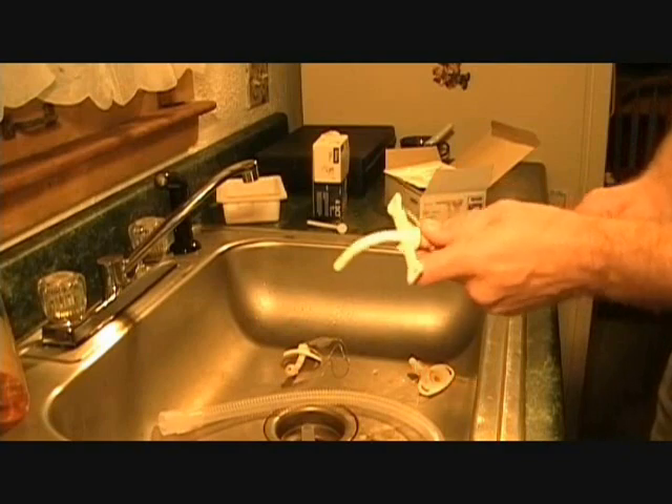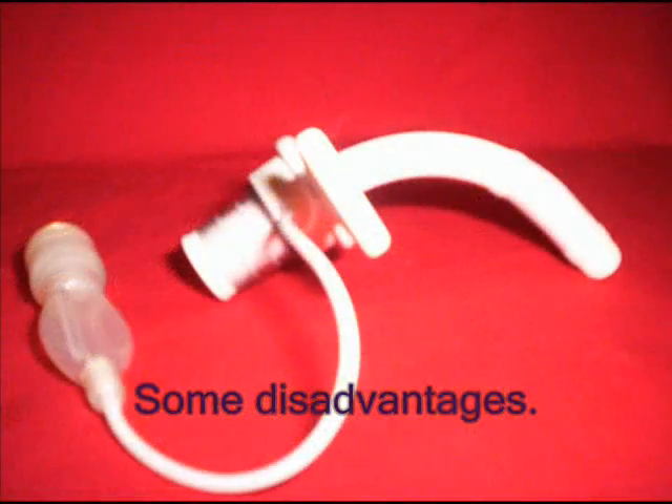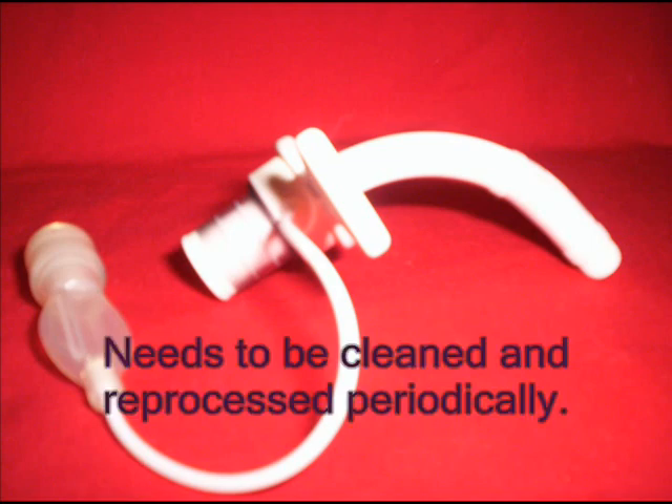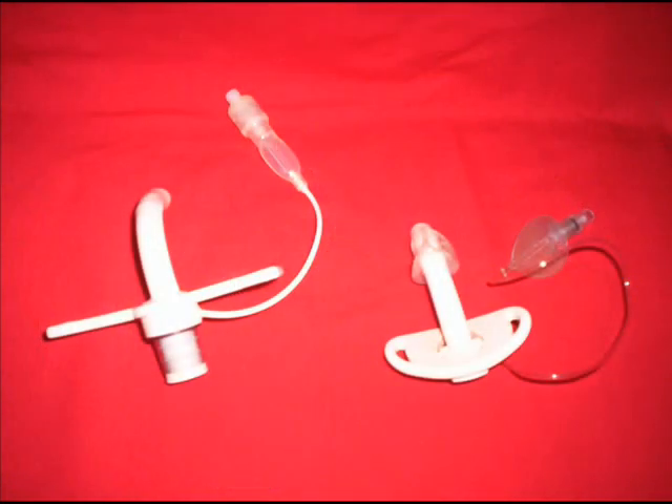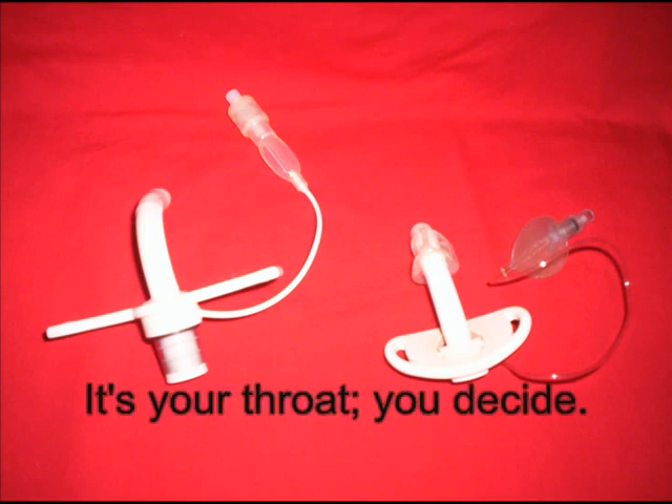That rubber can spring leaks, which is one of the disadvantages of that type of tube. Another disadvantage of the tight-to-shaft cuff — the high pressure cuff — is that it has no disposable inner cannula and must be cleaned every day. Hospitals don't like that because it's labor intensive, but I'll show you on the next blog that it takes only six minutes to clean and reprocess according to the manufacturer's instructions. So it's your throat — you decide.